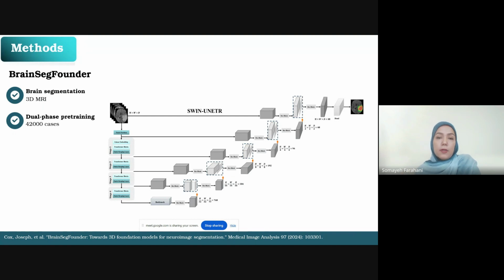And there are two types of foundation models in medical imaging. General purpose foundation models like MedSAM and MedKit, which are trained across a wide range of tasks and imaging types, and specialized ones, which are developed for specific modalities or organs. These specialized models usually give better accuracy and interpretability, and don't need as much labeled data as general ones for downstream tasks.